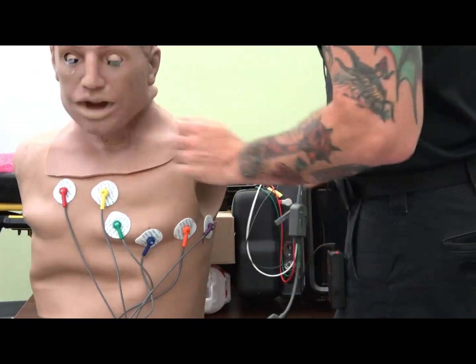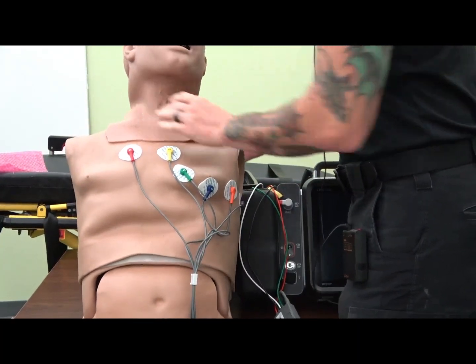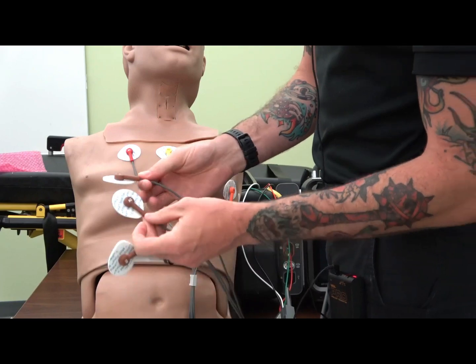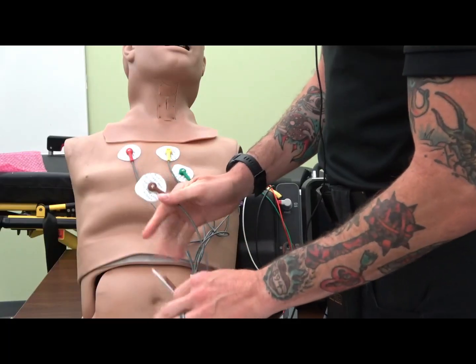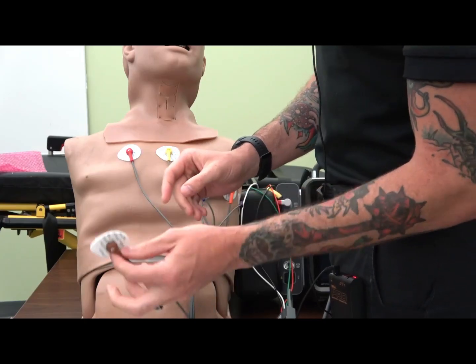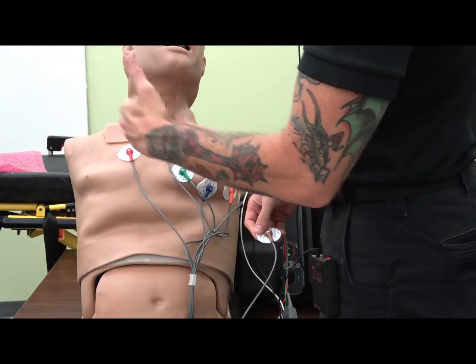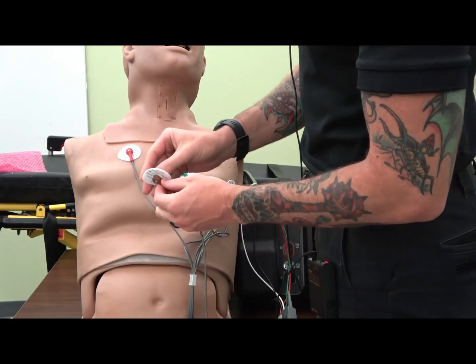And now I'm going to apply my additional leads. So the way these work on the LifePak 35 is they are kind of interchangeable. You have A1, A2, and A3, and wherever you put them, you will then just configure that on the monitor. So I'm going to put the A1 lead in V4R. So it's going to be the same spot V4 is, except just on the right side. So it's going to be fifth intercostal space, mid-clavicular.